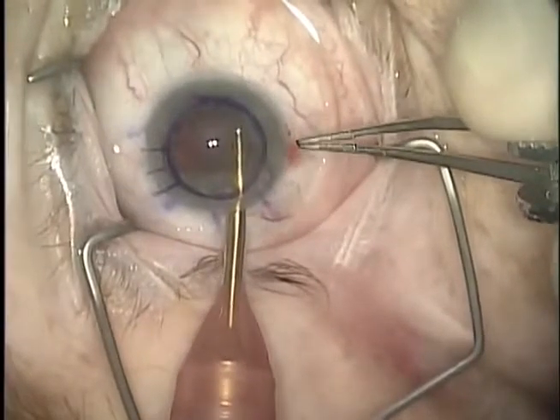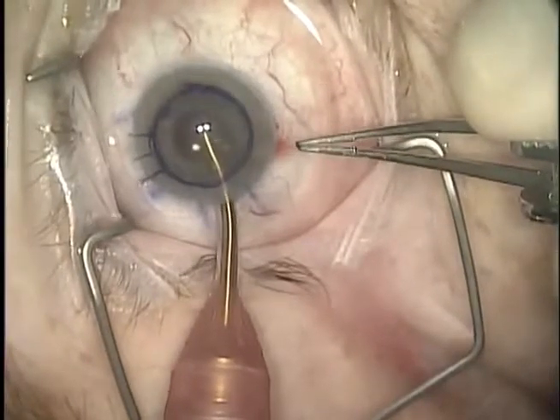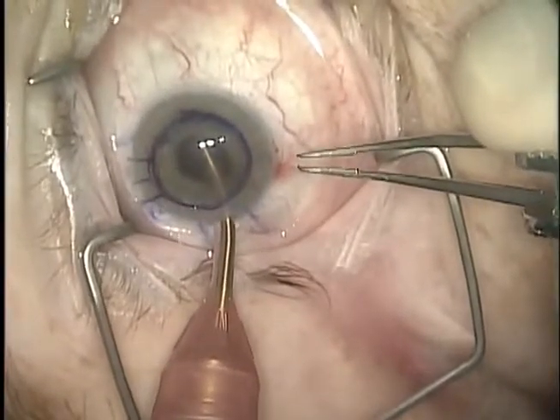An 8mm mark is made on the cornea using a manual trephine. Irrigation and aspiration is performed to remove all viscoelastic from the anterior chamber.